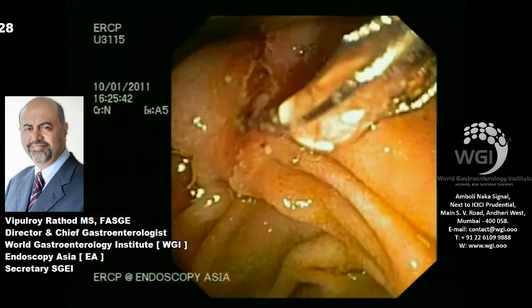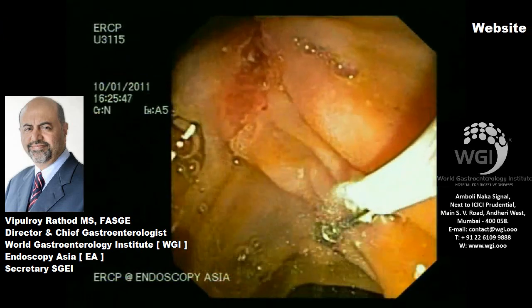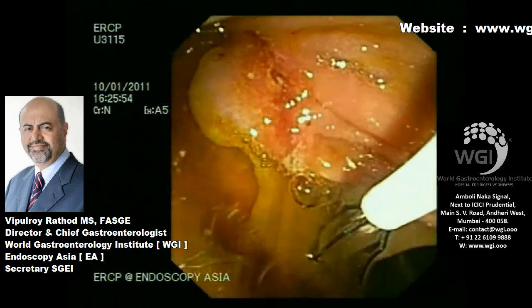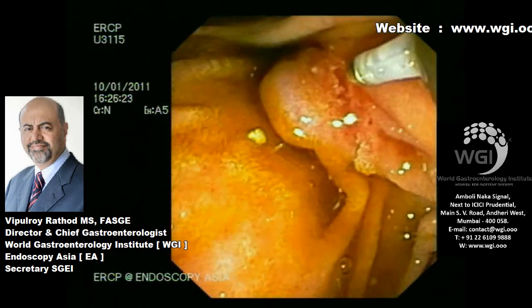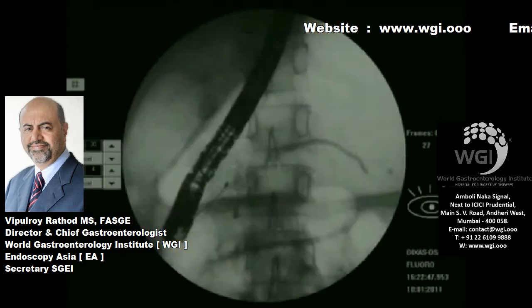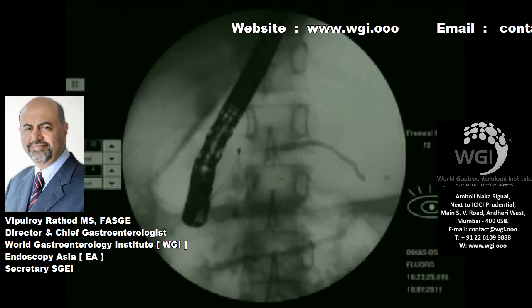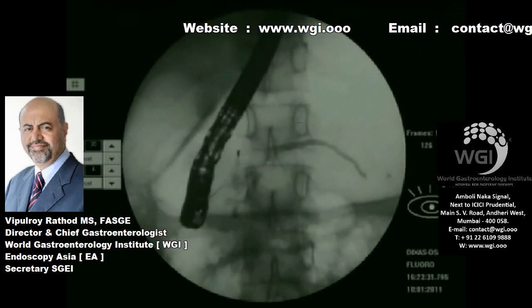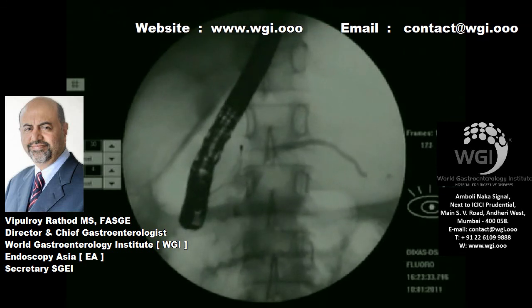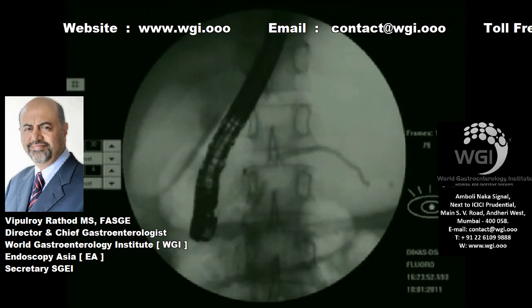Some concrements did come out. We feel this patient will need a formal ESWL. We are passing the Dormia again to continue clearance. You can see a large radiopaque stone between the accessory duct and the main pancreatic duct visible from the minor papilla.